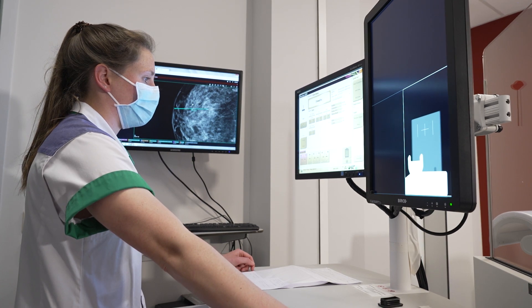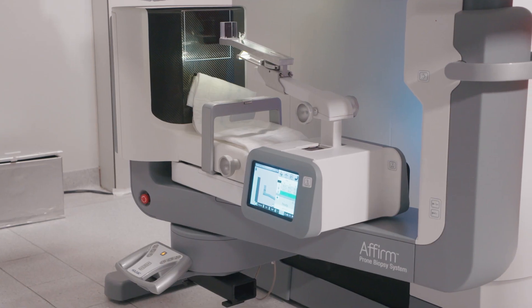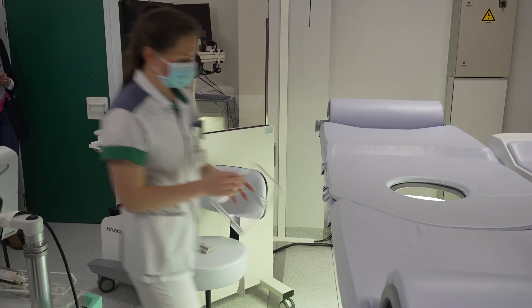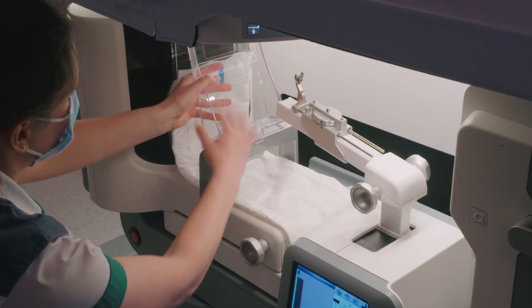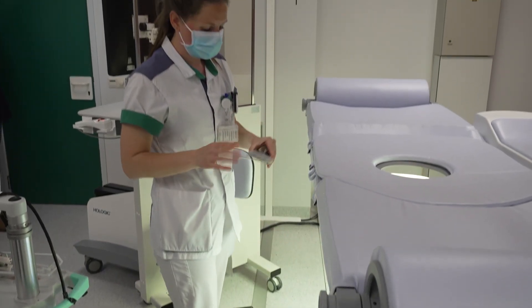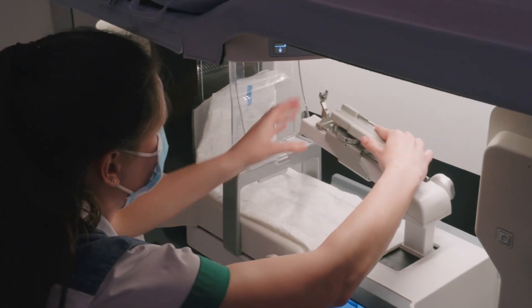Several X-ray biopsy exams are scheduled for the day. We start with a calibration check to make sure everything is okay in terms of system accuracy. Once the calibration check is completed, the dedicated compressor paddle and Encore Inspire fire forward piece are attached.